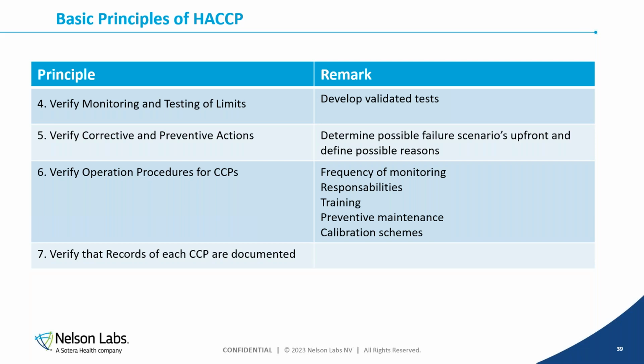The next thing is we have to develop validated tests and verify if what we said would be a limit is actually obtainable. So we now start to develop tests and starting to test at our critical control points. The next step is to verify corrective and preventive actions.